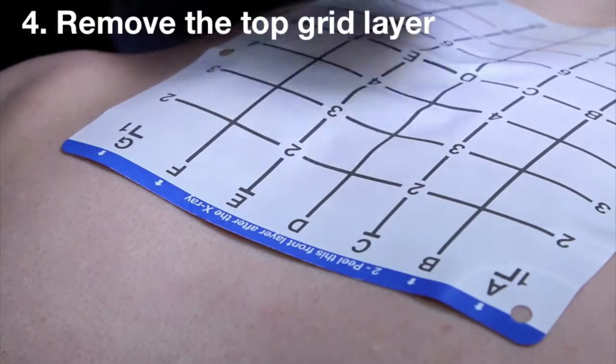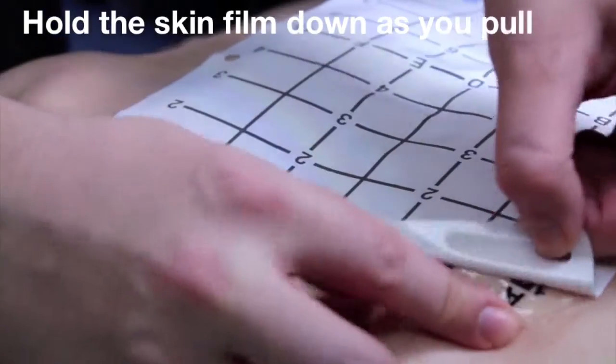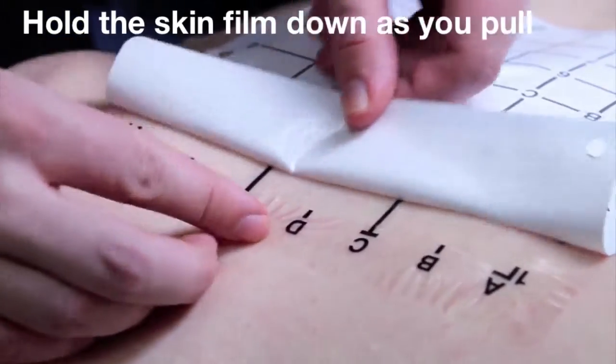Remove the top grid layer. Carefully peel from the blue tab at a corner. Separate from the skin film and pull, holding the skin film down as you peel away.